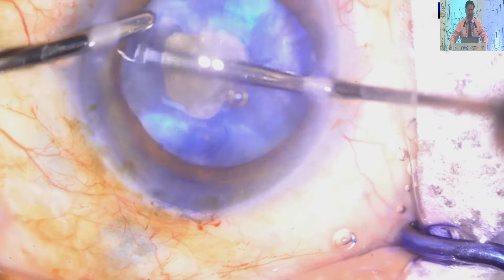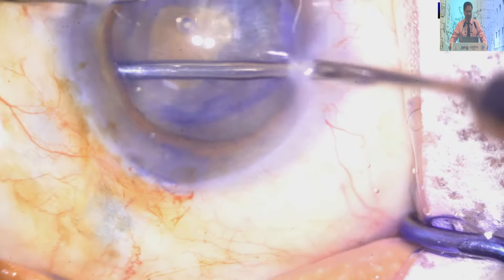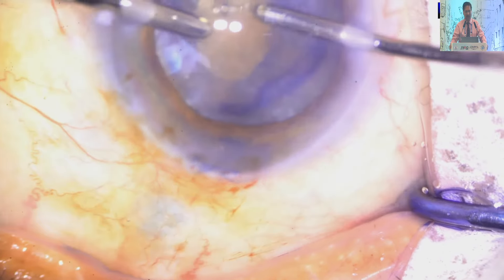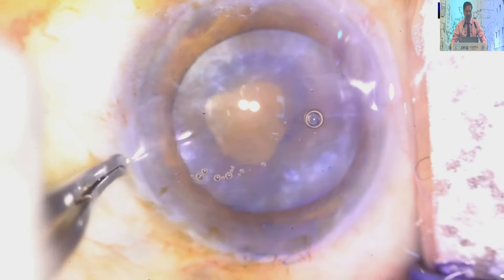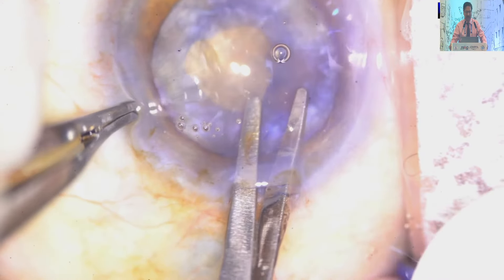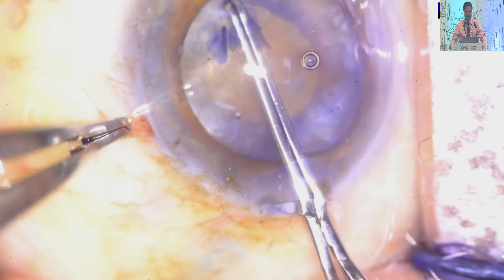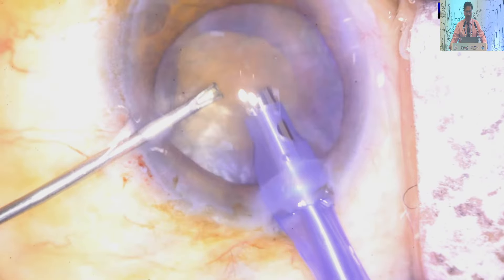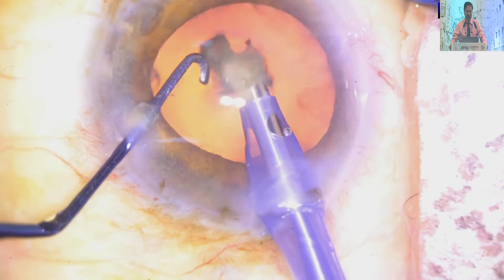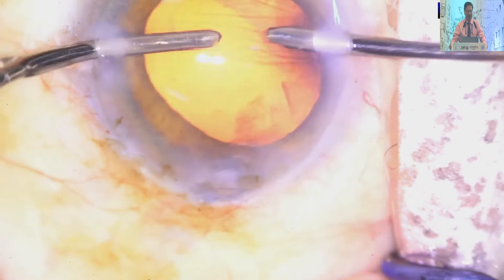Decompression of the capsular bag is the main important point in intumescent cataract. Before going for any of this type of cataract surgery, you can also perform anterior segment OCT to find out where the cortical material or fluid is located within the capsular bag — that is also helpful if you have anterior segment OCT. This is a hard cataract — in old age you often find this type. In some cases the capsular margins are fragile in intumescent cataract, so you have to take care of that as well.